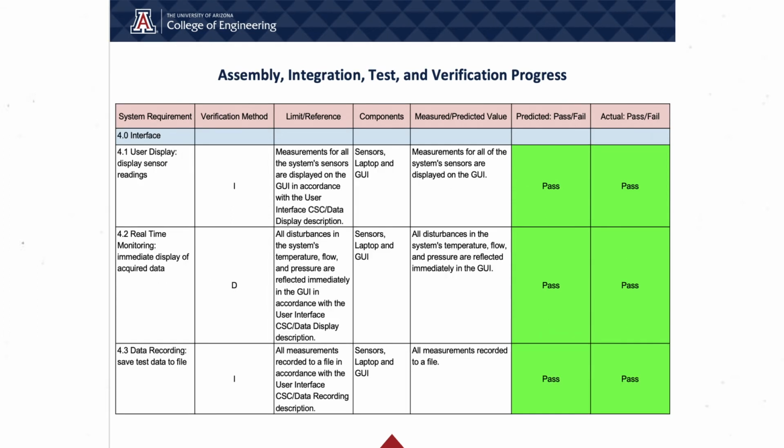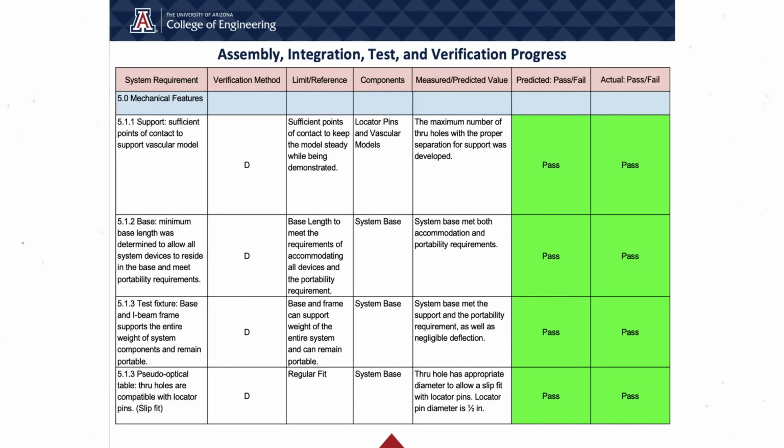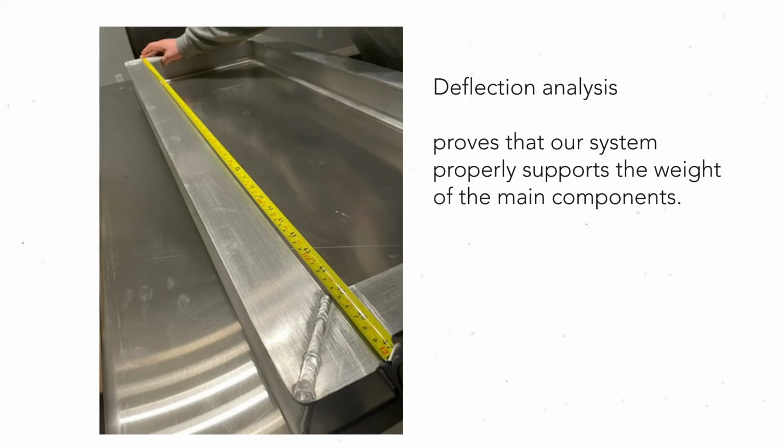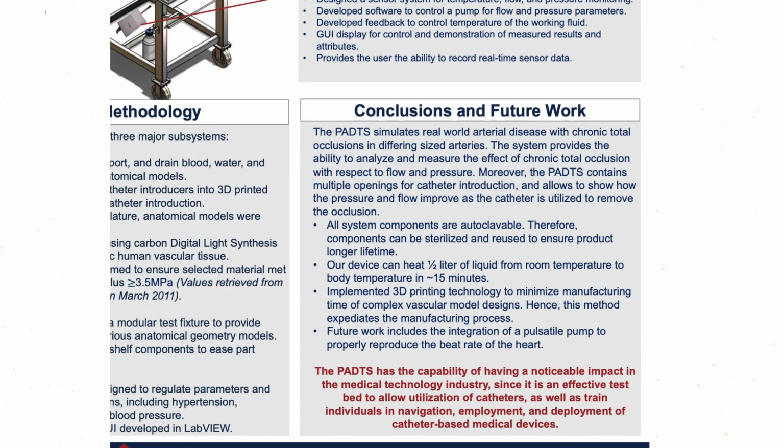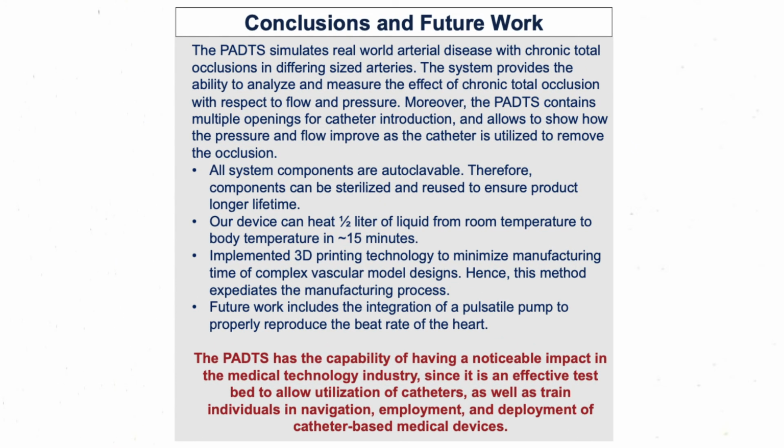Ongoing with the interface system requirements, we have verified the collection and display of sensor readings in real time. Finalizing with the system mechanical features, we have demonstrated that the system has the appropriate dimensions to support the entire PADTS. We performed a deflection analysis to prove that our system properly supports the weight of the main components. The PADTS system simulates real-world arterial disease with chronic total occlusions in different sized arteries. Future work includes the integration of a pulsatile pump to properly reproduce the beat rate of the heart.